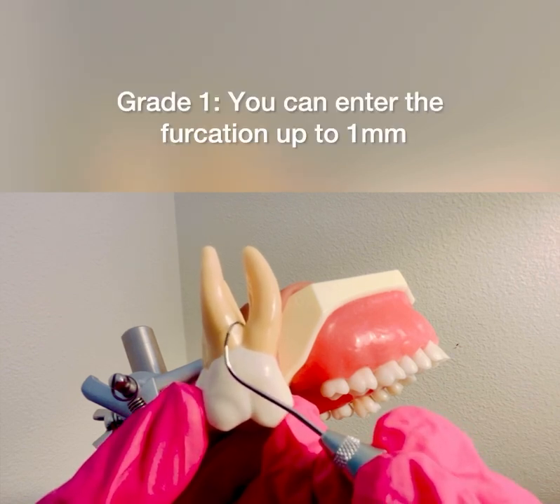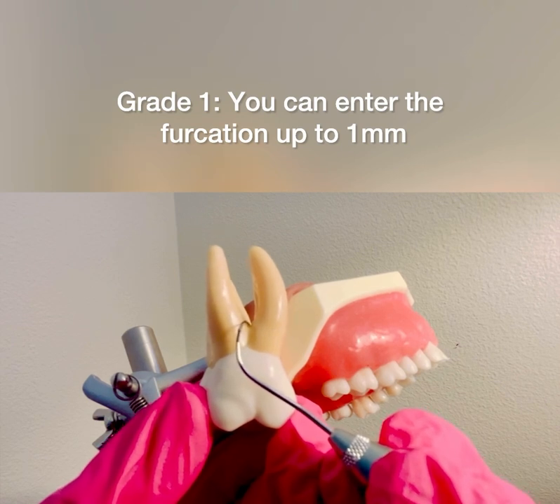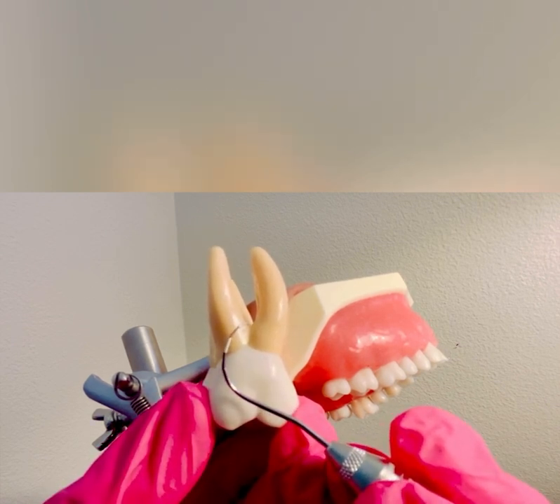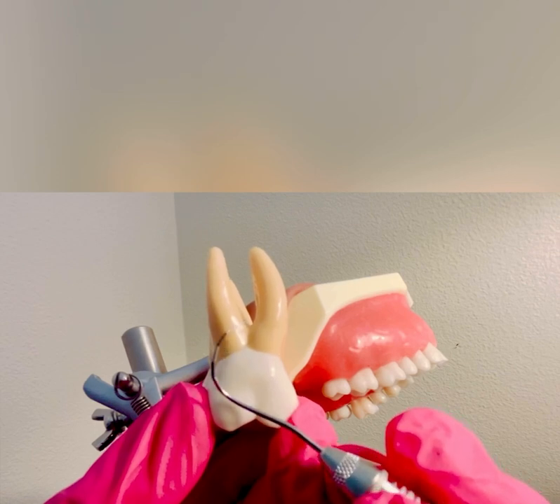If I can enter the furcation up to one millimeter, that would be a grade one furcation, and you're into about the silver marking.